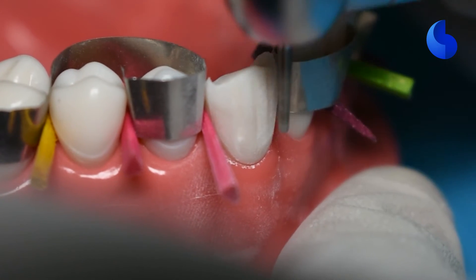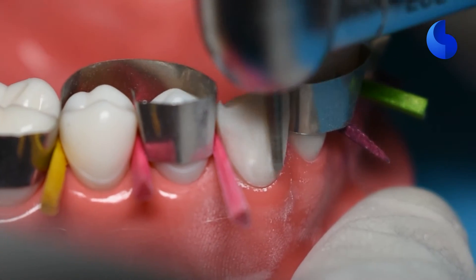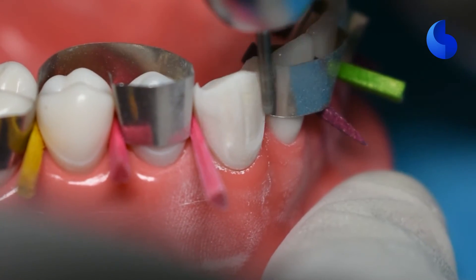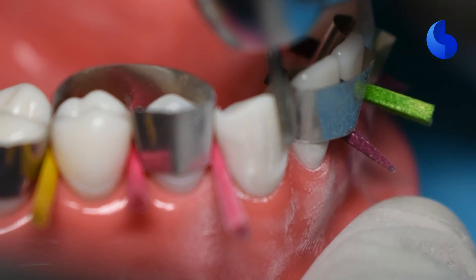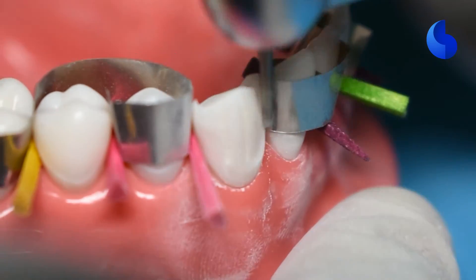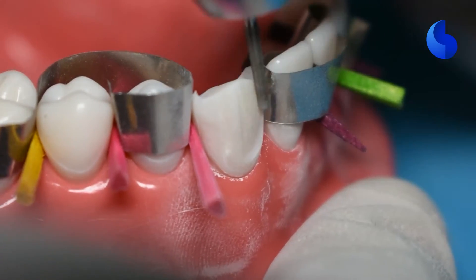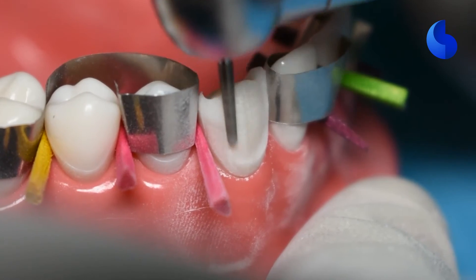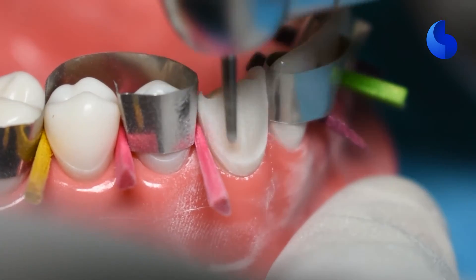Remember that there are two planes in which you reduce this tooth structure. One plane is the cervical component, which is parallel to the proposed path of placement. And then there's the incisal component, which is parallel to the original external facial contour of the tooth. A good way to practice this is when preparing the cervical component, you can align your bur with the lingual axis of the tooth and then transfer that onto the facial cervical component. Because whatever path of placement you establish at the cervical component on the facial surface, the lingual axial surface also needs to match that angle so you don't have any undercut.